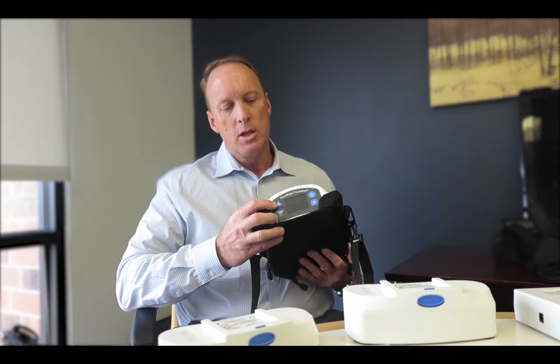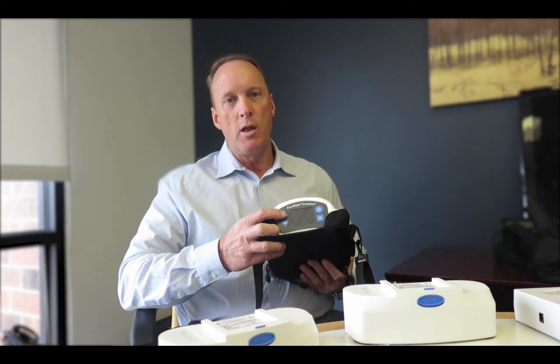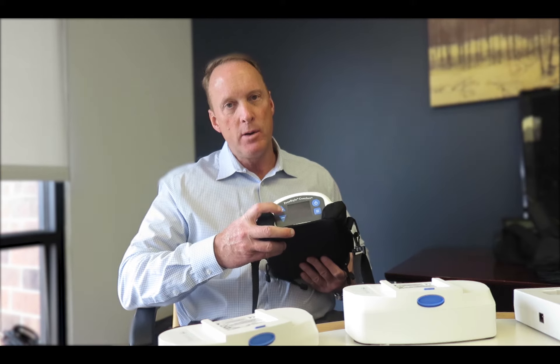To put it in test mode, you have an up and a down arrow key. All you do is press: up, up, down, down, up, down, up, down. And that will put it into test mode.